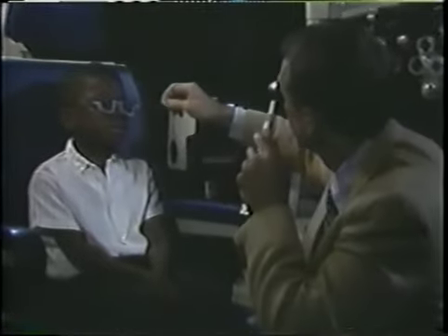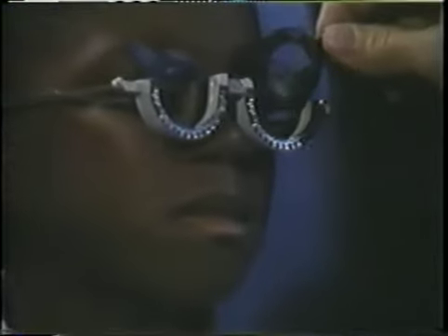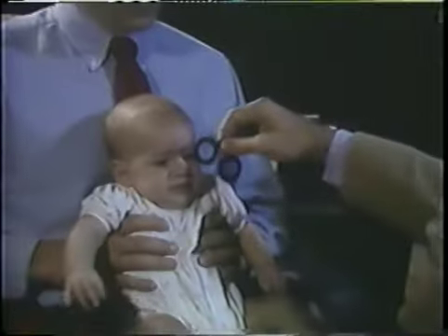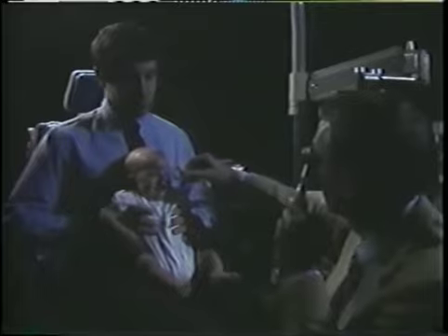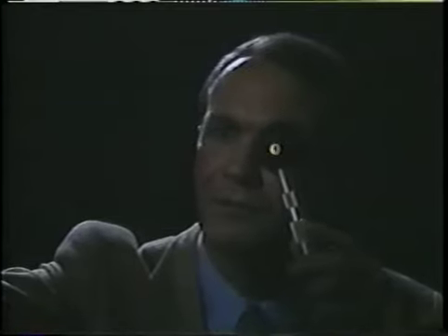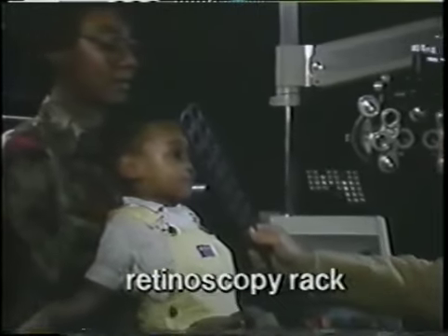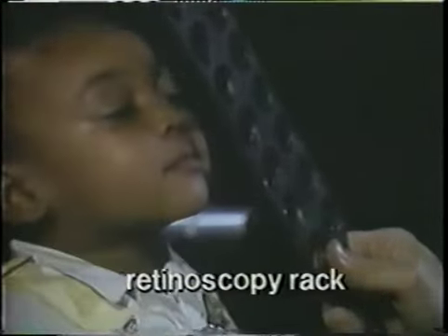Retinoscopy is often performed without the phoropter, especially with children. Trial frames can be used if the child is cooperative enough, or the lenses may have to be handheld, especially with infants. Turning all the lights totally off in the room and making barking or other noises to attract attention will also help with infants. Some retinoscopists like to use so-called retinoscopy racks for the refraction of young children, especially for examination under anesthesia in the operating room, where complete trial lens sets may not be available.